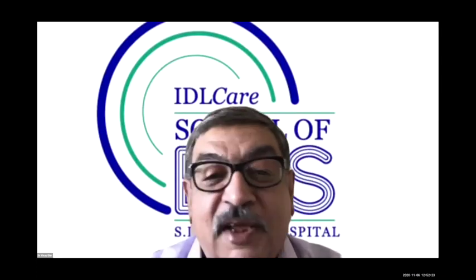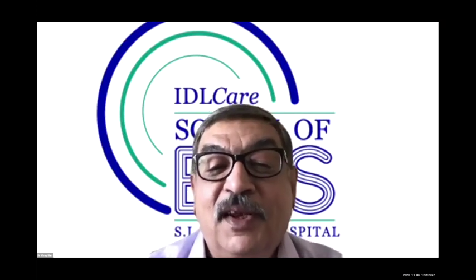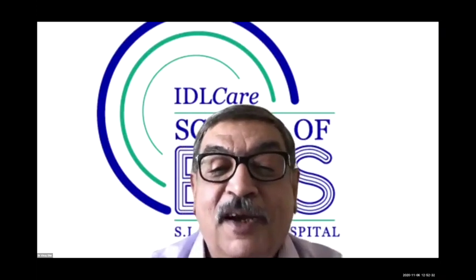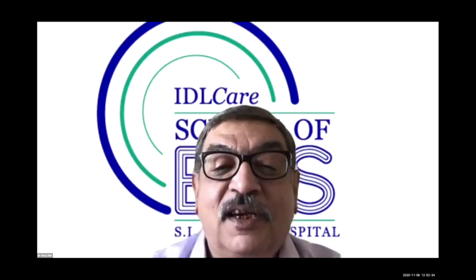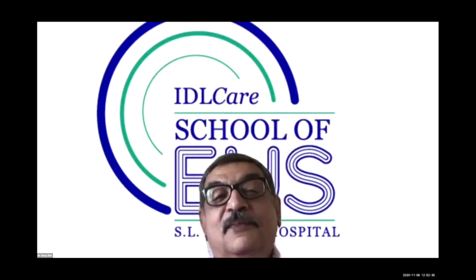Yes, yes. I prefer Nagi very much for PFC. It's my favorite stent, but anything else like GJ or bile duct or gallbladders, I think you need a little stronger stent probably.